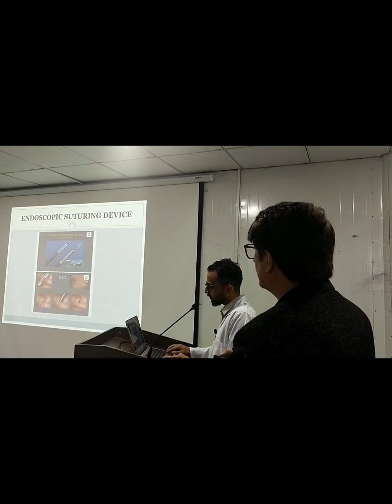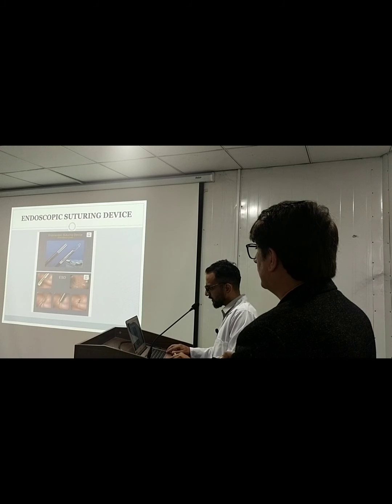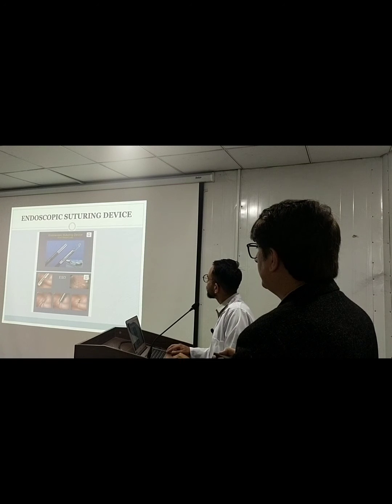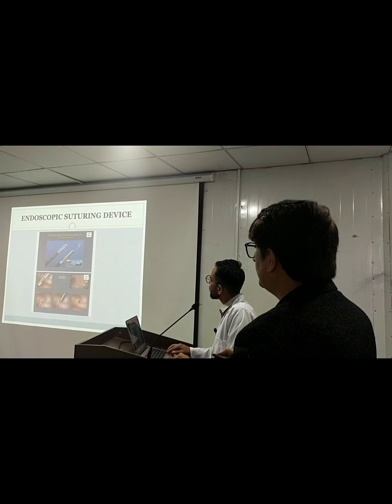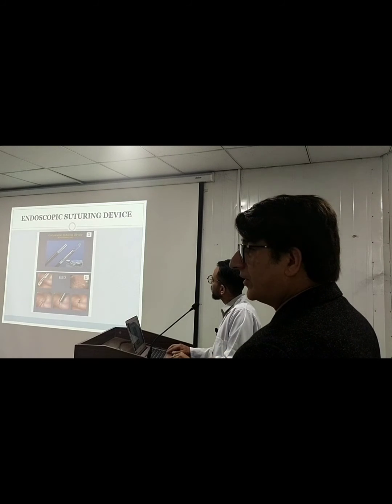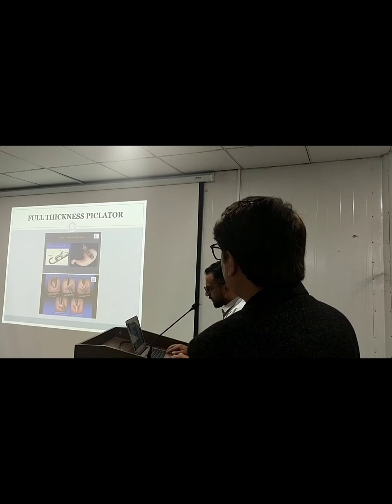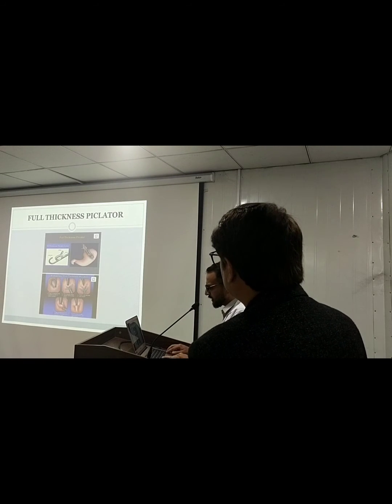Next one is the endoscopic suturing device. Basically these are endoscopic suturing techniques, through which we can treat, like ESD. We have EMR and POEM, which nowadays are being regularly done in some good centers. Then the full thickness plicator, which is also used as endoscopic treatment for GERD. So these are techniques practiced in developed countries nowadays.